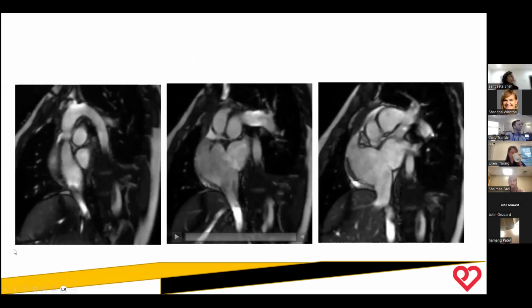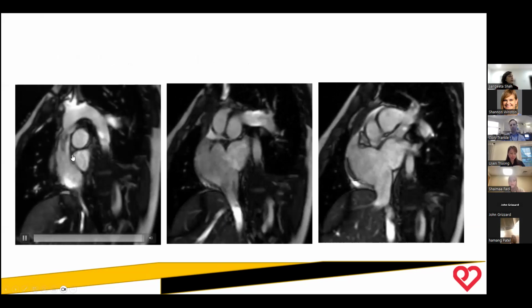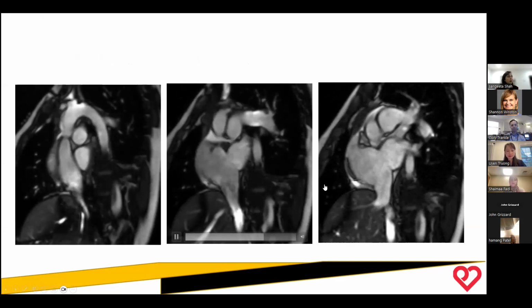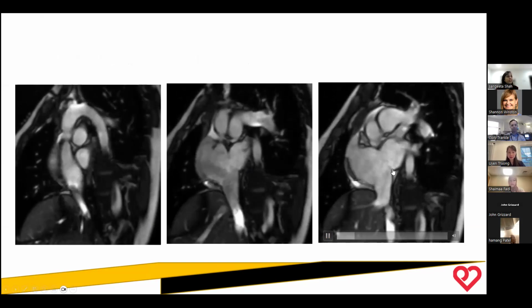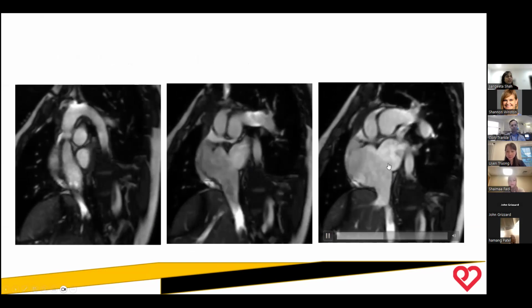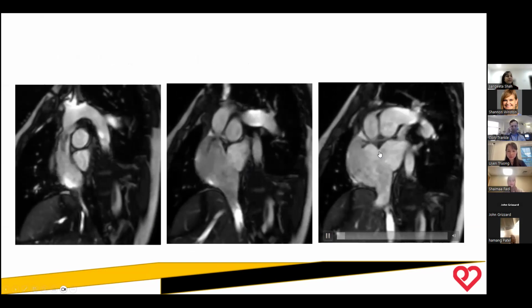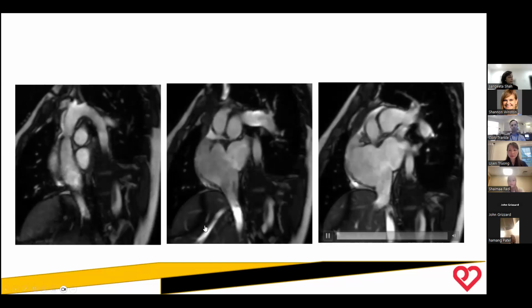In the short axis stack, it's very nice to see. Here's the left atrium superiorly, here's the right atrium, and you can see a distinct wall there, which helps for the diagnosis that it's not a sinus venosus defect. Here you see a large hole, and you continue in the stacks to see it in short axis. So this is important. And what I'm going to show in one more image is that the rims here start to look deficient.